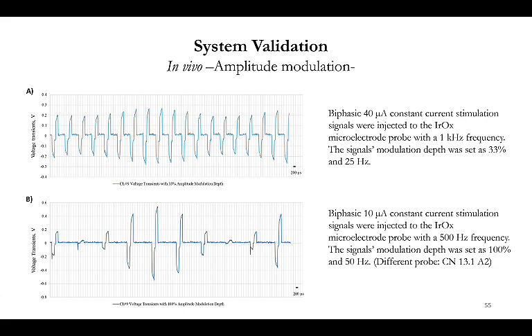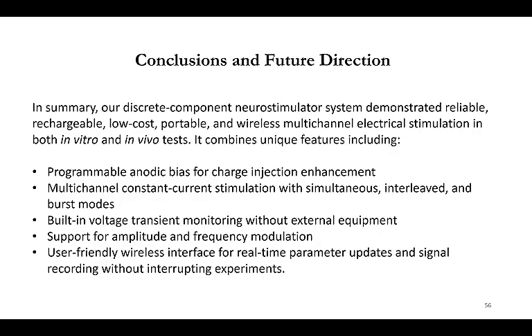So as a conclusion of this study, overall we've solved all 5 common challenges in neurostimulation applications. It is designed with discrete components, which means we can easily change certain components.